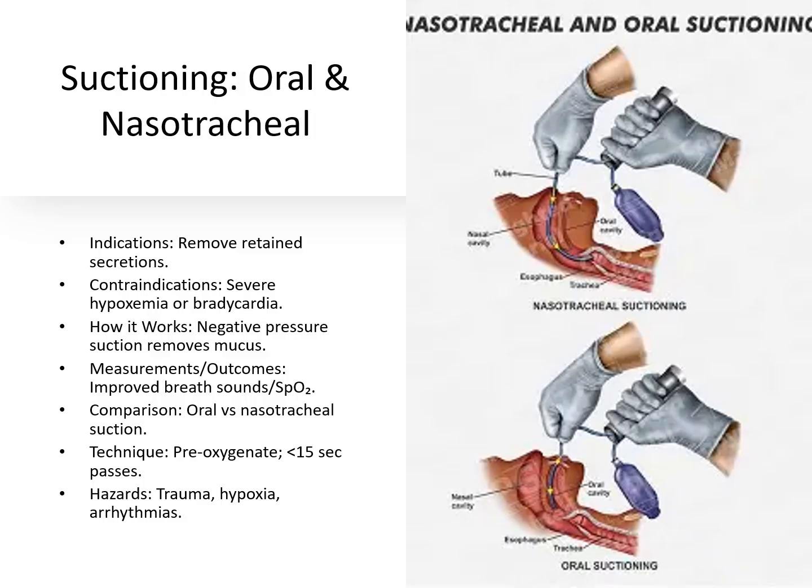Comparison: oral suction is easier, while nasotracheal is deeper and more invasive. Technique includes pre-oxygenating and limiting suction passes to under 15 seconds. Hazards include trauma, hypoxia, and arrhythmias.